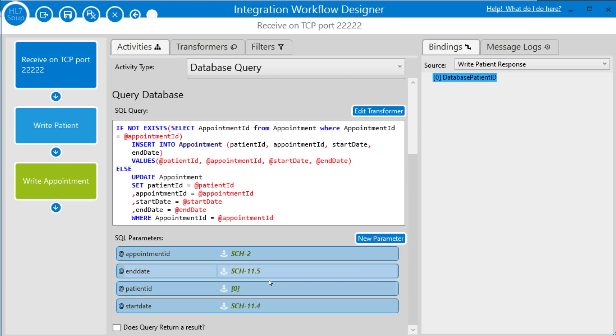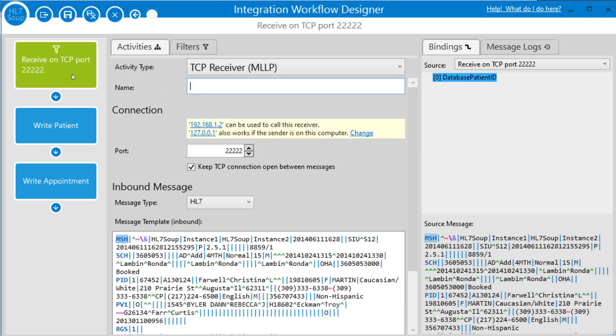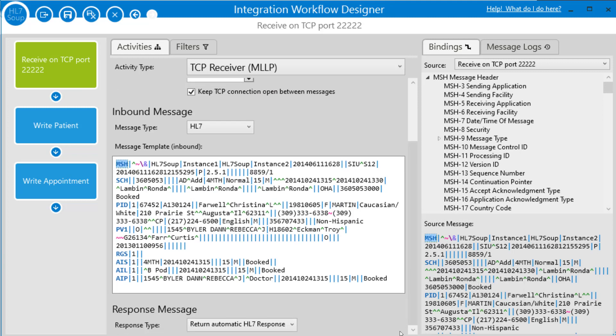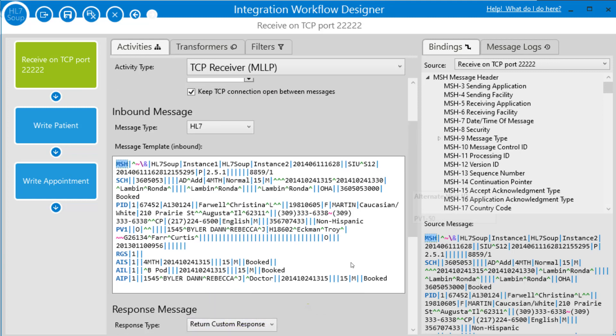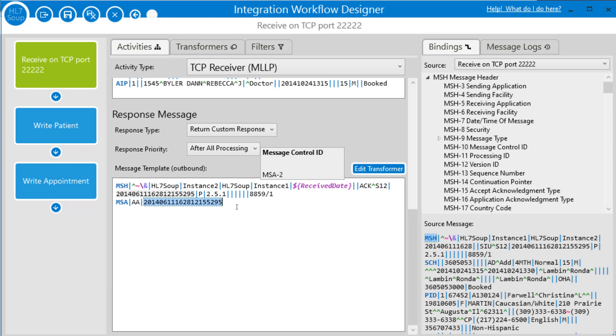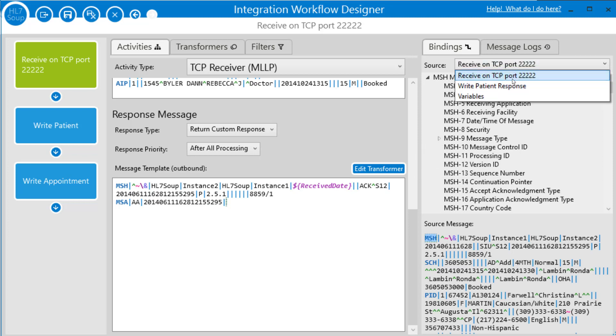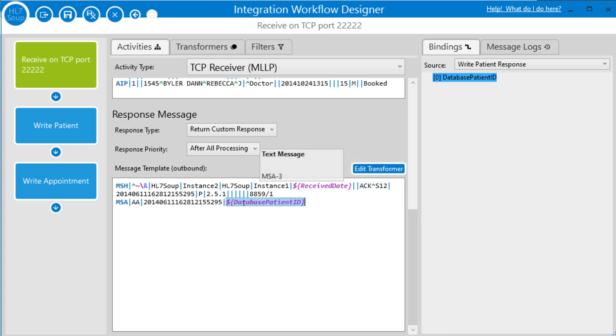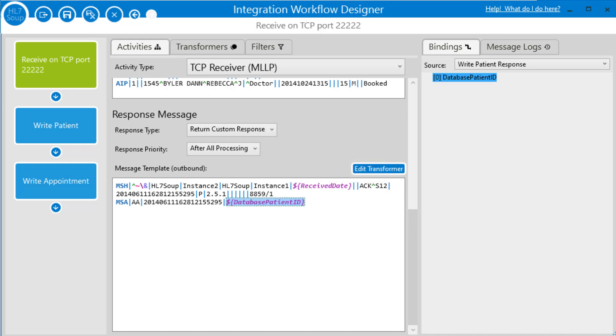So now it's going to use the patient ID generated by the database when it writes the appointment message. Let's also make it so the response that we send back via HL7 also includes that patient ID. So I go back to the first activity. And I'm just going to choose the response type to return custom response. And I'm just going to append to the outgoing message, another caret. And I'm going to get the source from that patient response again. And just drag that into the outgoing message that we're going to be sending back to the sender. Okay, so I'm just going to click save and close and try this out.